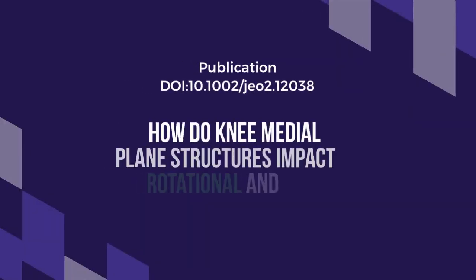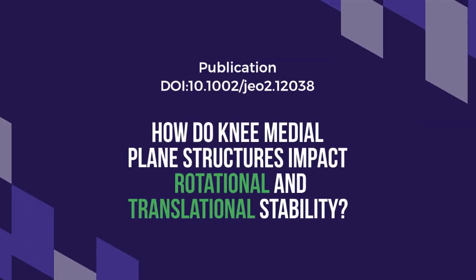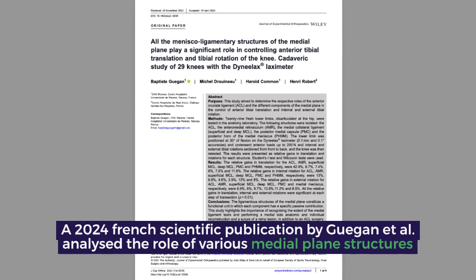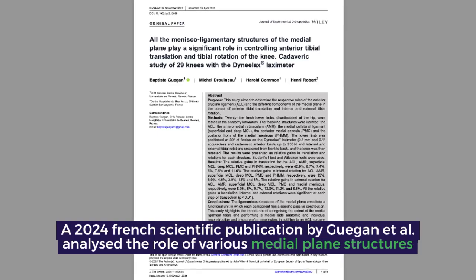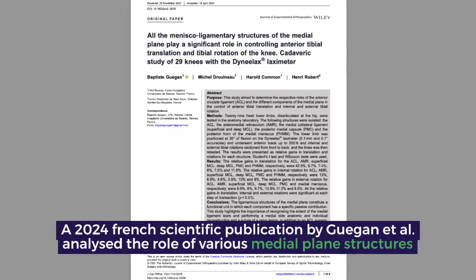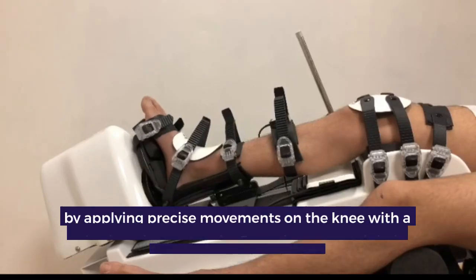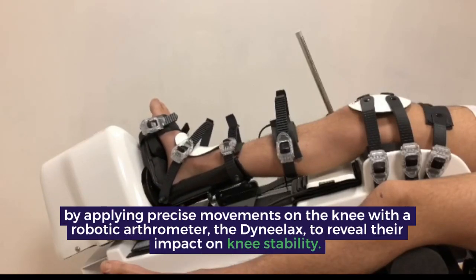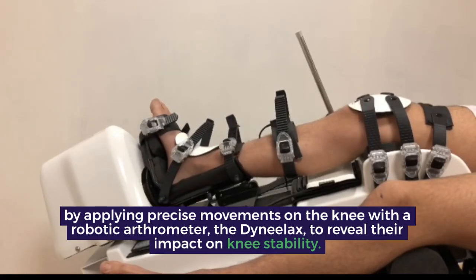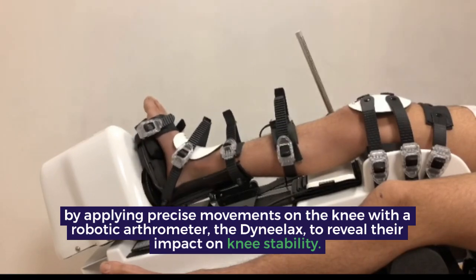How do knee medial plane structures impact rotational and translational stability? A 2024 French scientific publication by Gwagin et al. analyzed the role of various medial plane structures by applying precise movements on the knee with a robotic arthrometer, the Dynelax, to reveal their impact on knee stability.